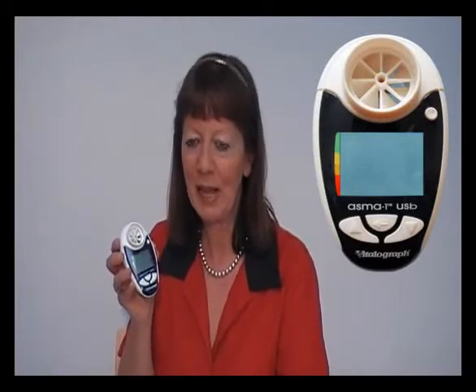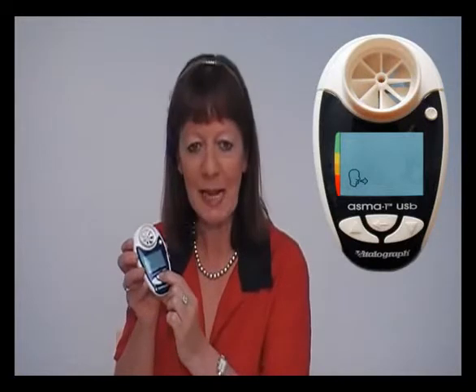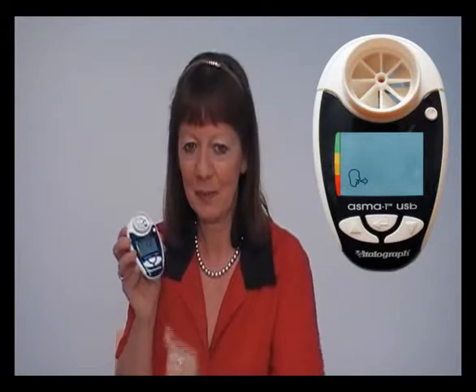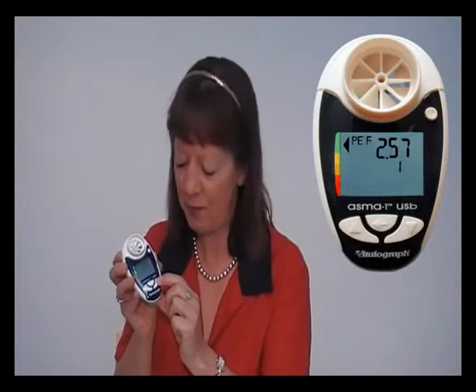Once you have a number of sessions stored in the AsthmaOne, you may wish to review the history. In order to do this, simply switch the device on and hold the enter button for three seconds. You can then scroll up or down to scroll through the previous test data.